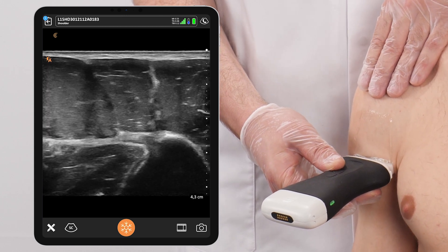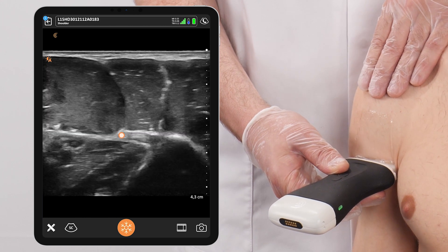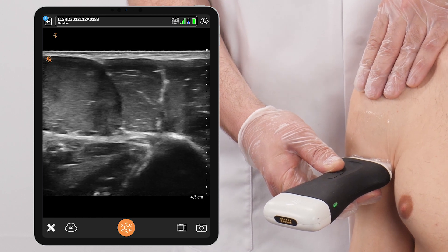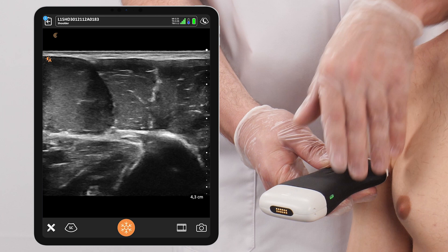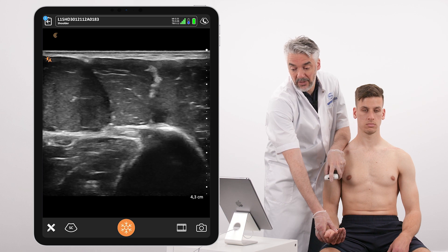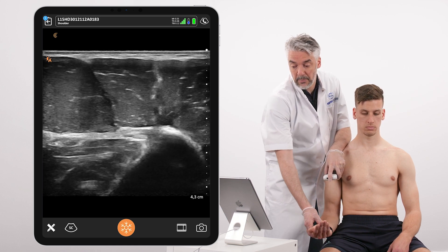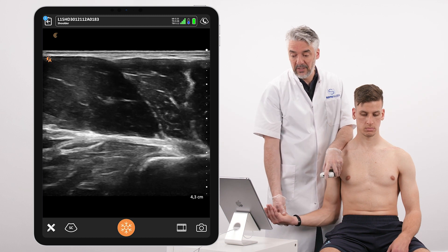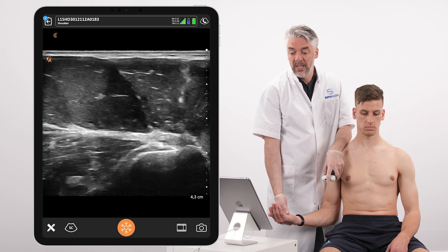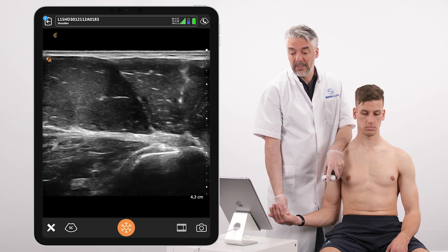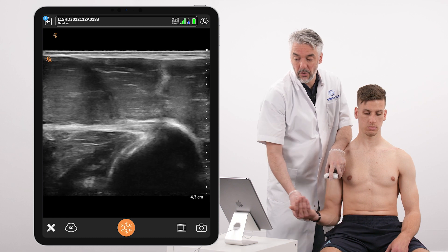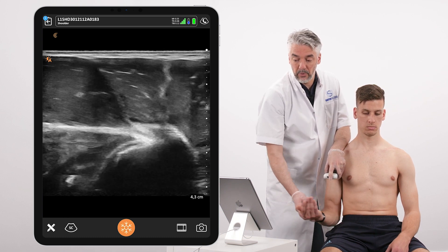At this level you can see the pectoralis major tendon in long axis plane, but the short axis of the long head of the biceps. This is a point where the biceps is stabilized by two structures: the pectoralis major and the latissimus dorsi. The pectoralis major is hyperechoic in the middle of the screen, and with external rotation of the arm you can also see deep to the bone the latissimus dorsi. Both latissimus and pectoralis stabilize the long head of the biceps, and this insertion can be monitored by observing external rotation.